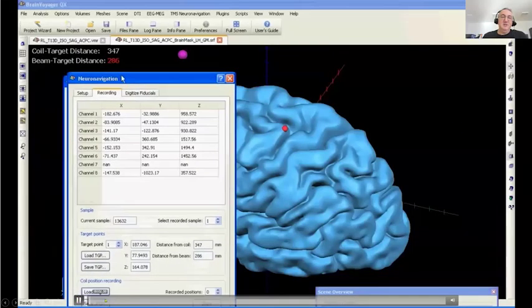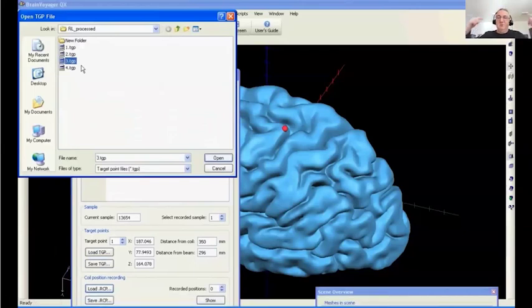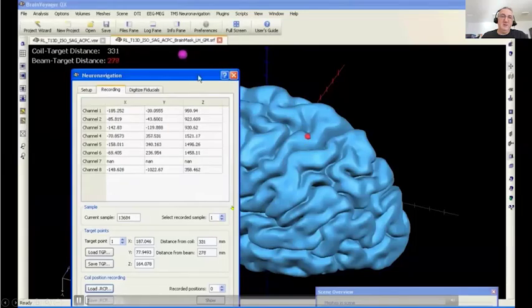So what does the neuronavigation look like? We usually have some markers on the coil, also on the subject, usually at least 3 points, so you can define the 3D space for the system. Then you have the volumetric MRI from the subject, which is then converted to a realistic 3D model. And then you decide what your target is, which area you want to stimulate, and you save them. So in this example, we want target number 3.